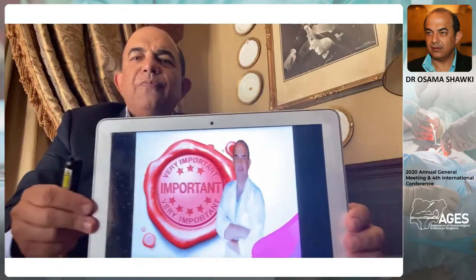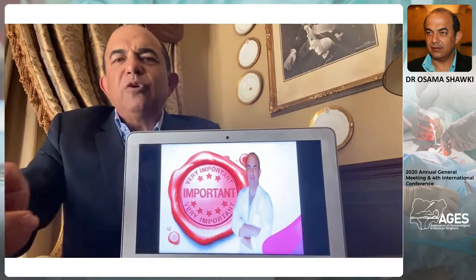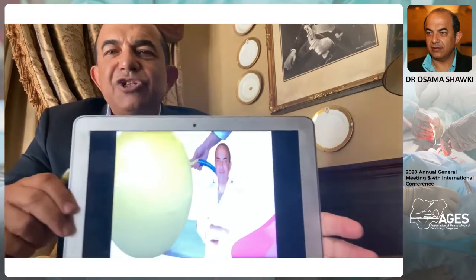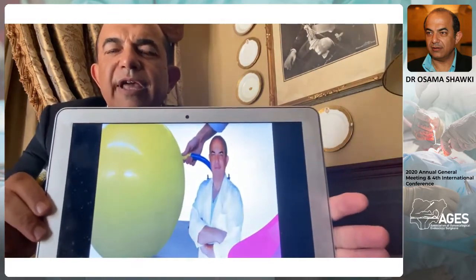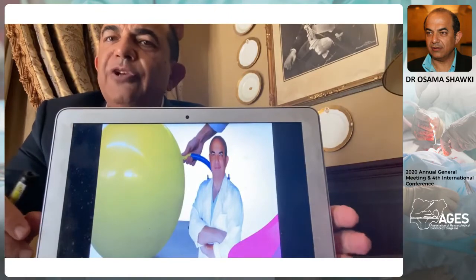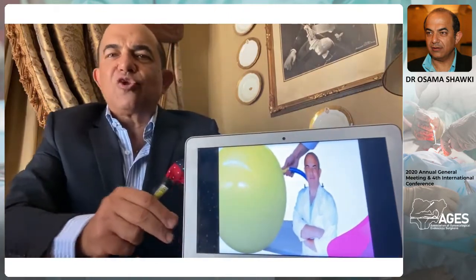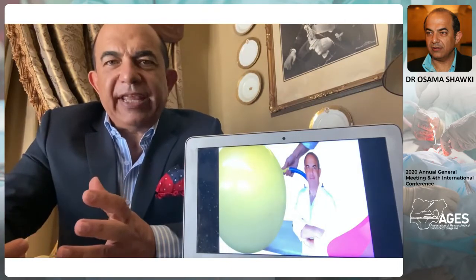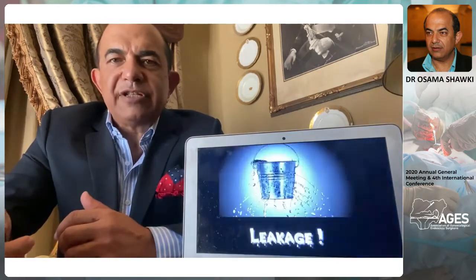Okay, so let me bring you to what is the most important point for visibility. It is distension. Look at this balloon. Without pneumoperitoneum, you cannot do laparoscopy. And without proper distension of the uterine cavity by the fluid, you will not see well.